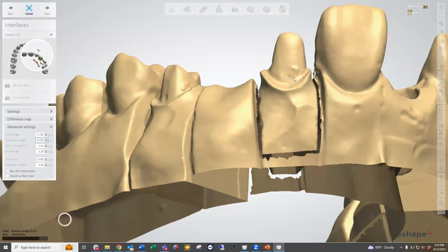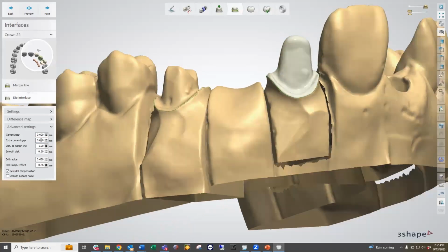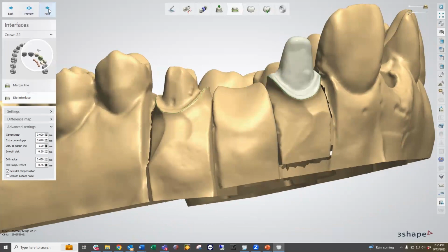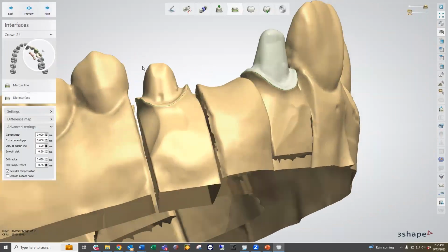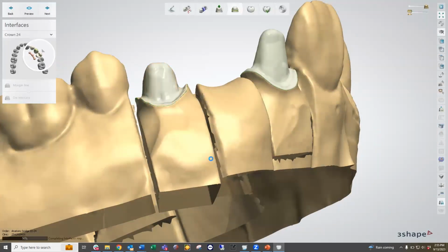And we can just see what that change looks like applied here. It's not going to be much change, so you can just change it by like 10 or so microns at a time, seeing which is going to be the best setting for you at that time. So now applied to the first unit, it's now going to apply that setting to the second unit. So I'm going to make the same change, just bumping it up 10 microns. Then we'll move on to the next stage.